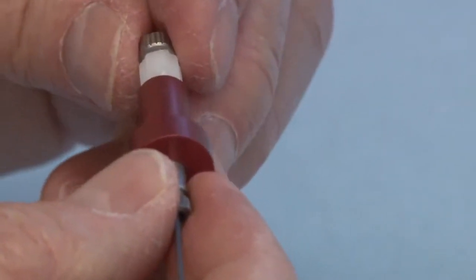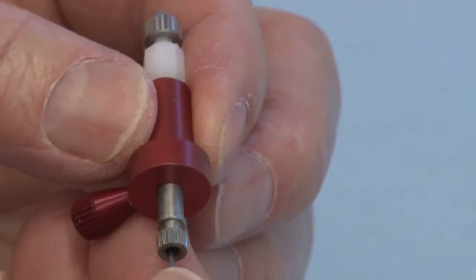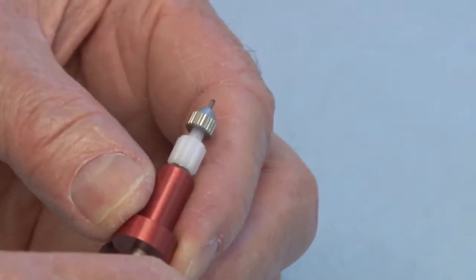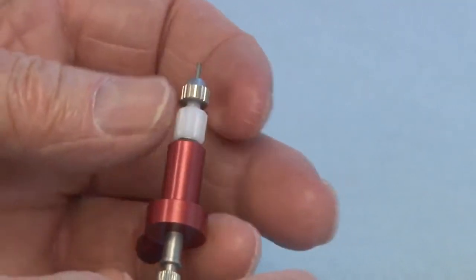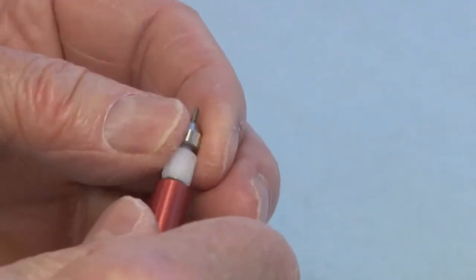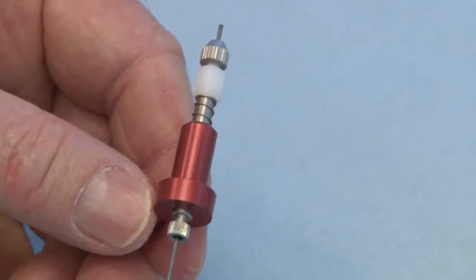And to do that, this metal part here has to be loose, and you slide it all the way through. There, you see. And then to hold it in position, hold the lead in position, you tighten the metal cap. And now your writing pencil then is ready to use.